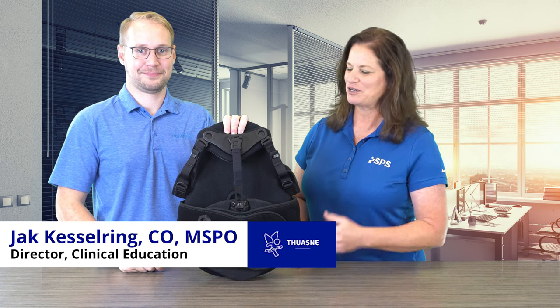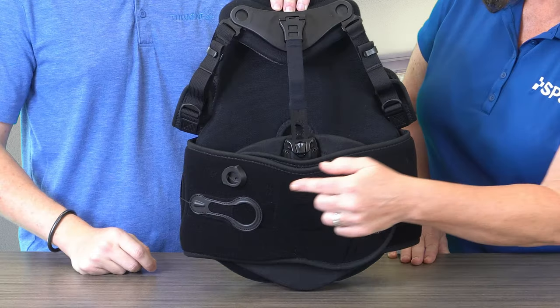Hi, I'm Liz with SPS. Welcome to the Quick Tip. In this segment, we're reviewing the Sleek Max TLSO and the parking garage.